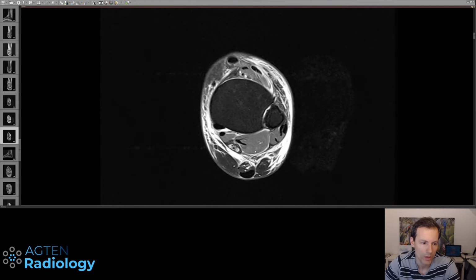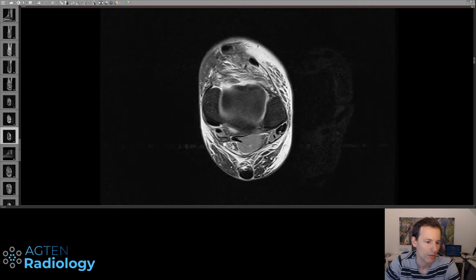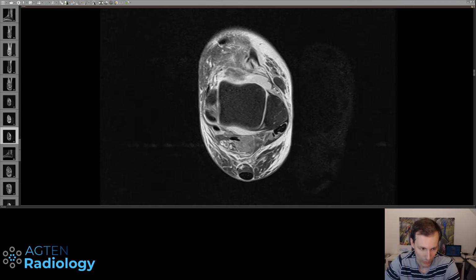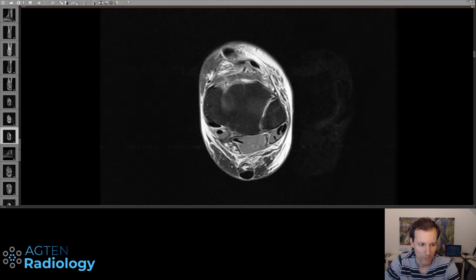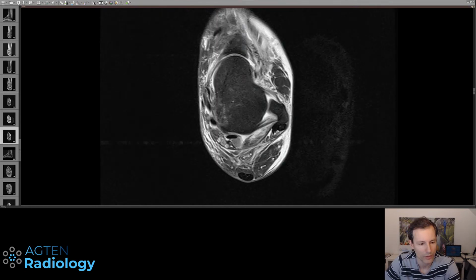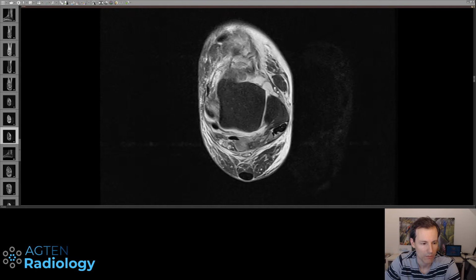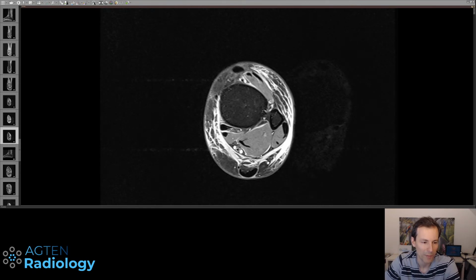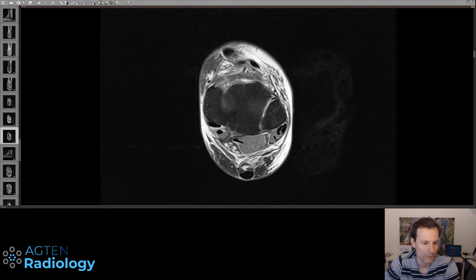But with all these anatomic variants you can see down here, they are most commonly missed on reports, like even peroneocalcaneus internus or flexor digitorum accessorius longus, etc., which might actually be clinically relevant. They are frequently not reported. Even a soleus accessorius, which is a very large muscle bulk here. And the reason is because it just doesn't look abnormal if it's not injured. But always give this musculature a good look.